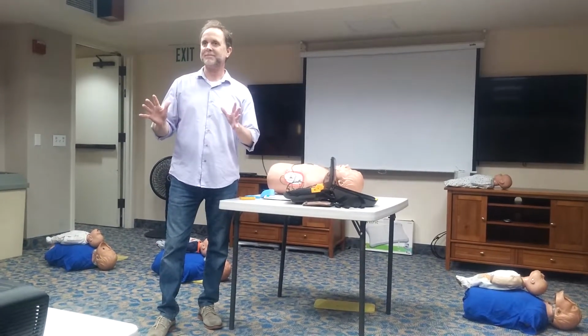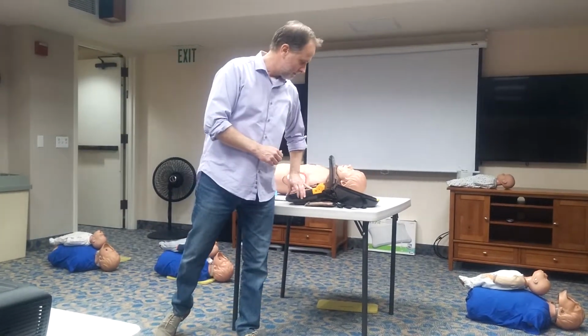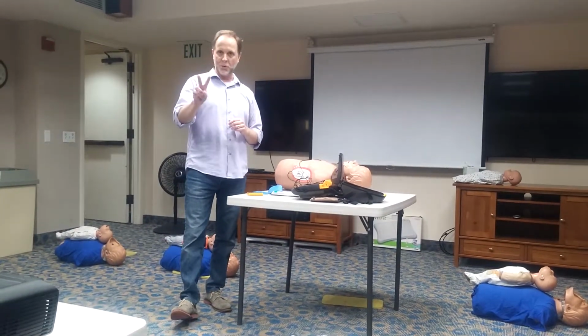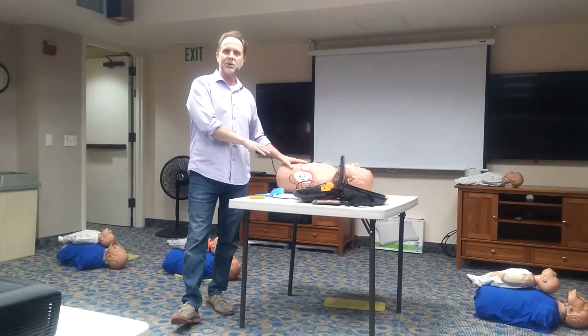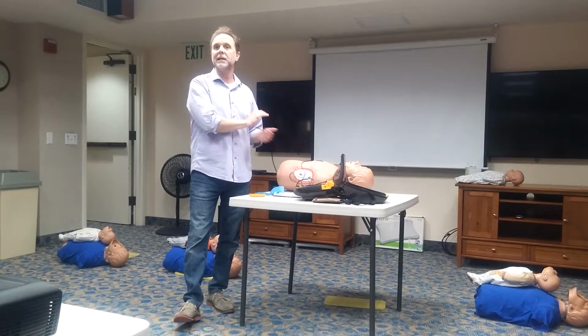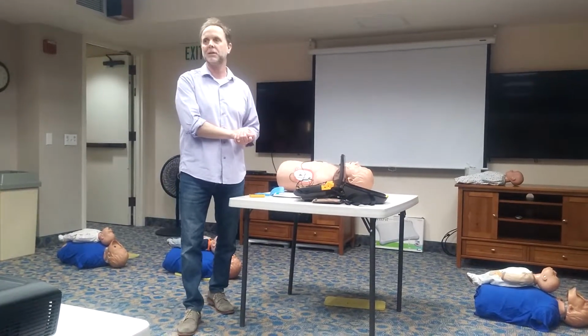Any questions? Once again, do not touch patient. Once again, the machine is only going to identify 2 heart rhythms, ventricular fibrillation or ventricular tachycardia. Don't be afraid to use the machines when indicated. It's not going to shock anybody that doesn't need to be shocked, unless maybe grandma's holding grandpa's hand. So you want to make sure everybody is clear.